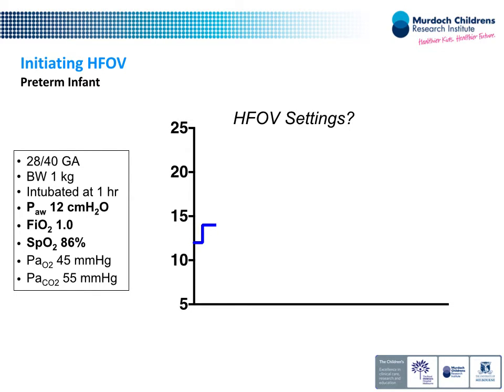What I'm trying to get at is we're setting a number, okay, and this is a pretty important thing. We're doing this as a rescue therapy here, right? And it's a powerful tool, the oscillator. We should know why we're picking these numbers. So that's why I asked why, because I'm interested in what your rationale is. I'm not saying it's right or wrong, I'm just interested in why. And the reality is everyone says 2 above, right? Across outside of the Netherlands.